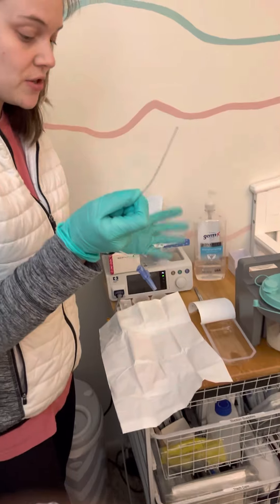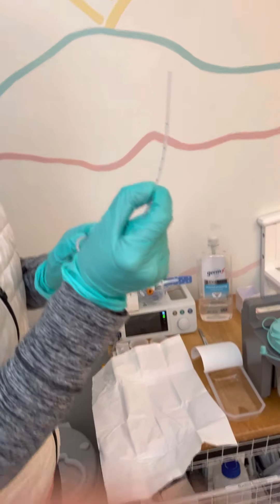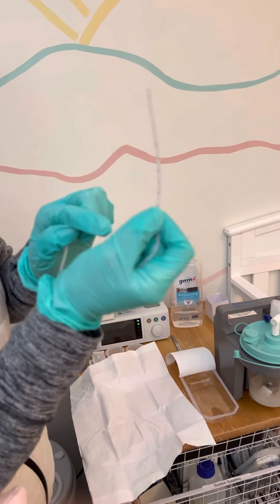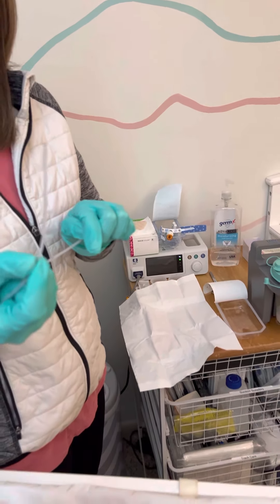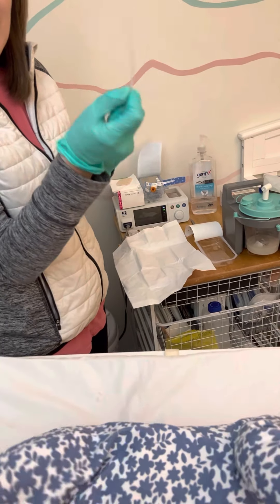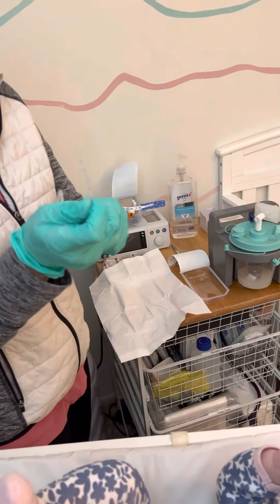Grab your suction catheter — you can touch it with both hands right now because you have not touched anything else since you sanitized your hands and put on your gloves. Find the number nine; that is where we currently suction to. Put your fingers right there so you don't go further than number nine, which is the end of her trach. If you went further it would probably instigate a cough or gag reflex. Once you find number nine, hold it there and do not move your fingers or touch anything else with that glove.